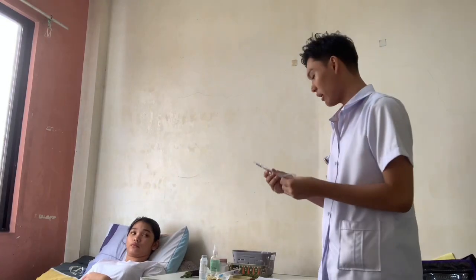Then I'm going to connect the barrel into the aspirating needle. Make sure that the connection between the barrel and the needle isn't loose. Okay, then set it down.